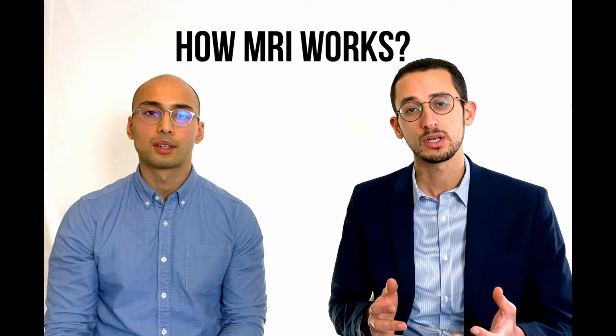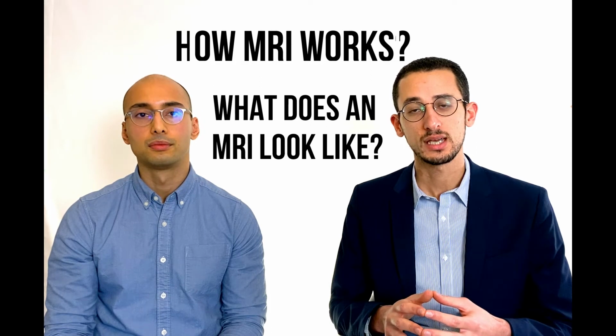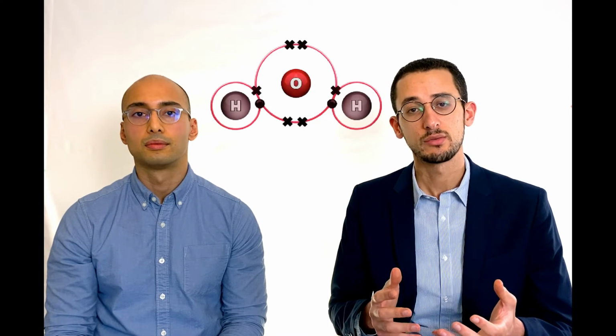In today's video, we'll talk to you about how the MRI scan works and how your back will look like in the MRI scan. Our body is formed mostly by water and fat. And if you remember from your chemistry class, the water is formed by two hydrogen atoms and an oxygen atom. These atoms move in random directions.